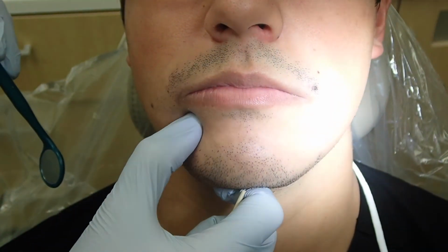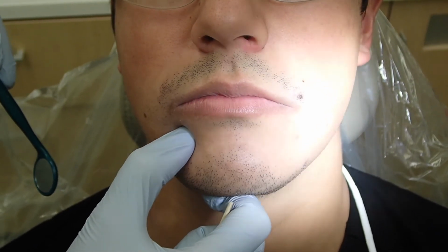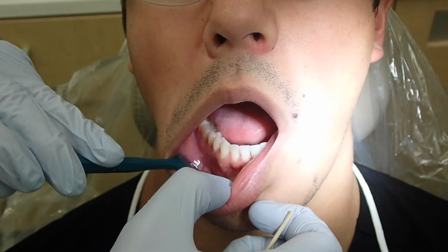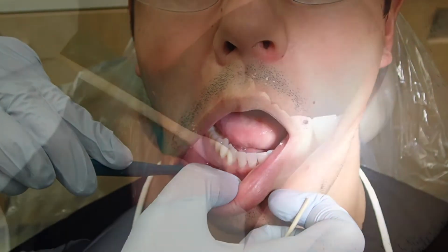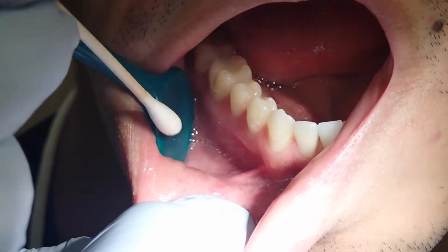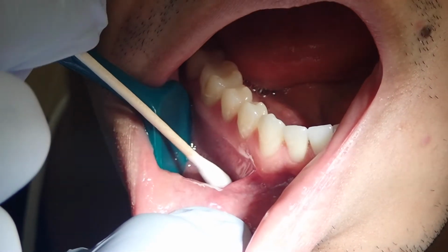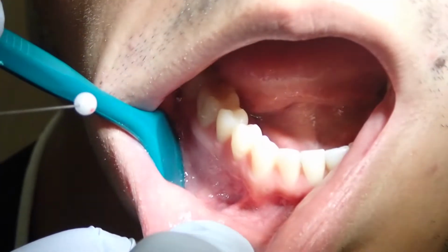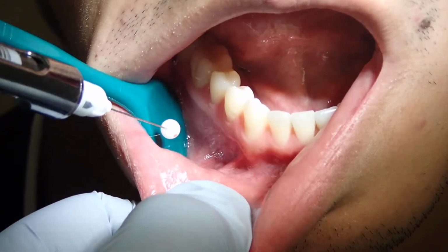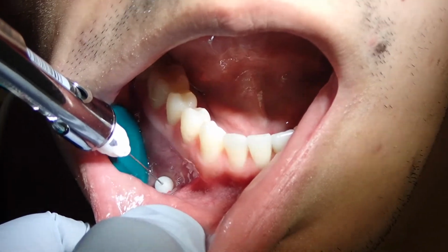The mental foramen can sometimes be palpated both extraorally and intraorally, and is typically located between the apices of the first and second mandibular premolars. The first and second mandibular premolars, along with the depth of the vestibule, serve as the anatomical landmarks for this injection. It is critical to avoid inserting the needle directly over the mental foramen. Doing so may cause permanent injury to the nerve tissue found therein.